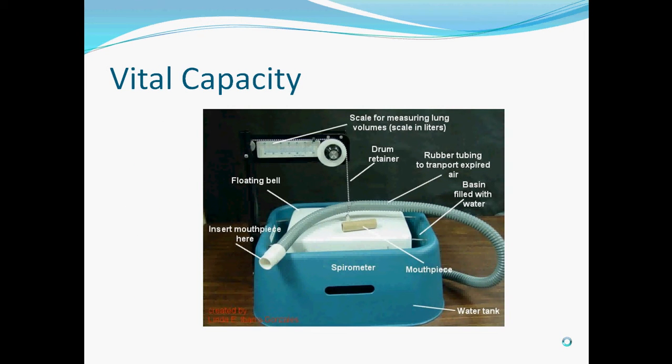We measure vital capacity with a spirometer, which is shown here. The spirometer is essentially used by blowing into the tube, and it measures how far the inside bucket, which is surrounded by water, rises. The increments up top that the chain is lined up with indicate how much volume, or vital capacity, there is. Each inch increment represents 1 liter.